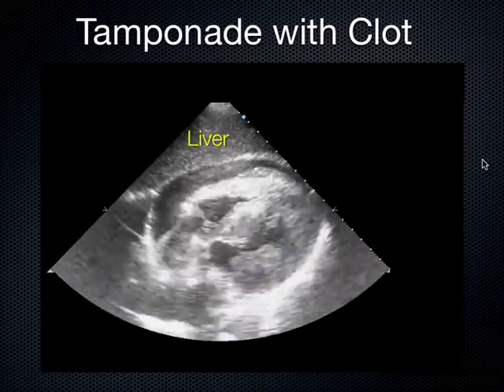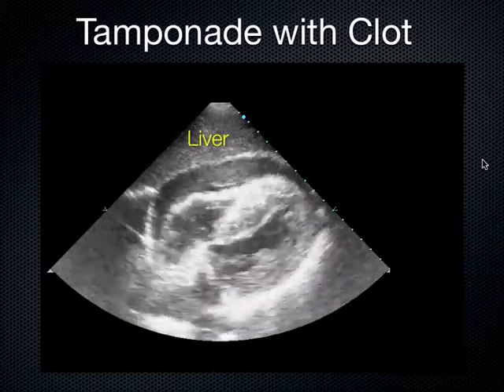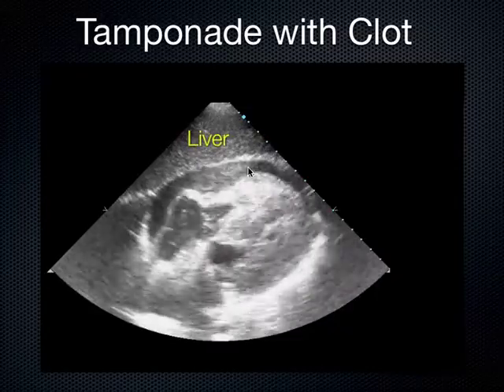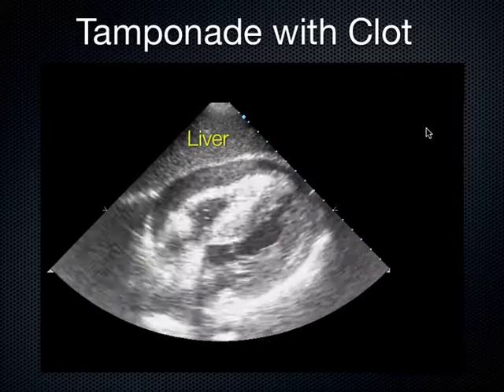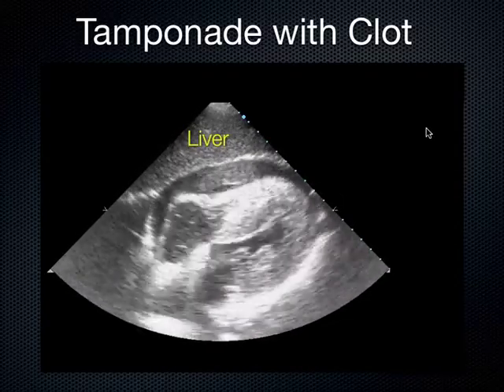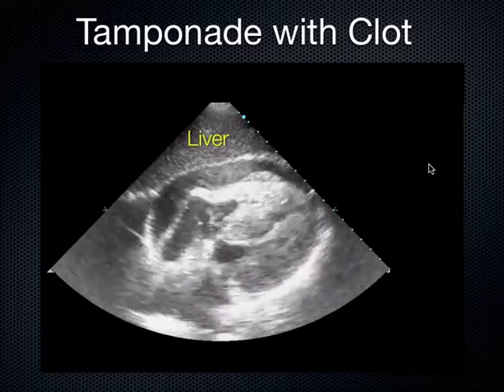Luckily, fat pads are less than 1 centimeter in thickness almost always. So if you're wondering whether it's a clot or a fat pad, clots certainly can get a lot larger than 1 centimeter. And these are 1 centimeter hash marks along the edge of the screen. A quick way to eyeball anything on ultrasound, any machine, any manufacturer, is to look at the dots along the side of the screen.